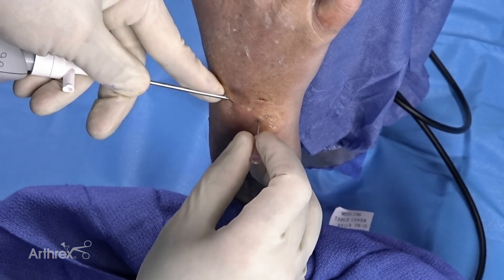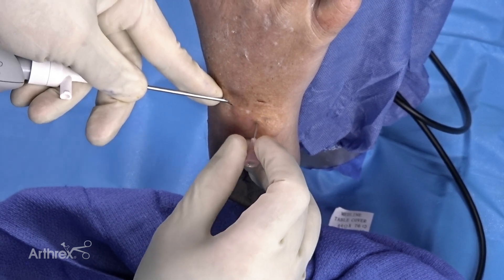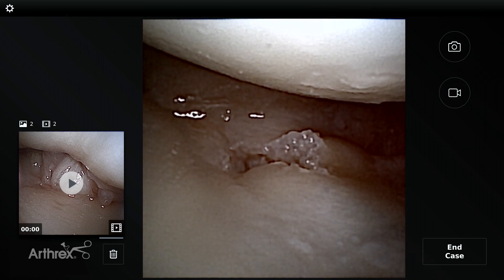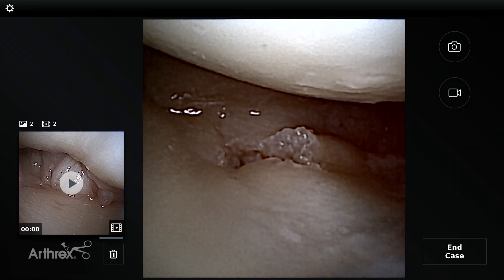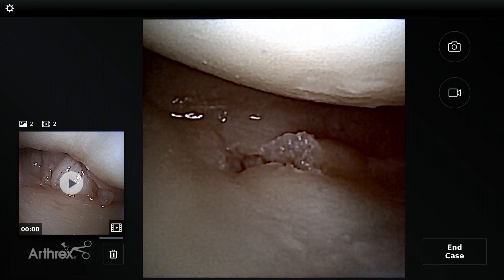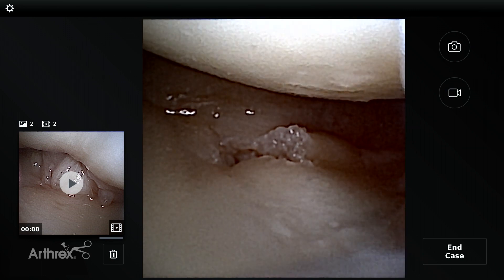So now we're doing DRUJ arthroscopy. Many of you are saying, how am I going to get into that joint? It's a tiny joint, it's hard to see inside there. A little trick we can do with the nanoscope is I'm actually in the 3-4 radiocarpal portal looking over at the TFCC.